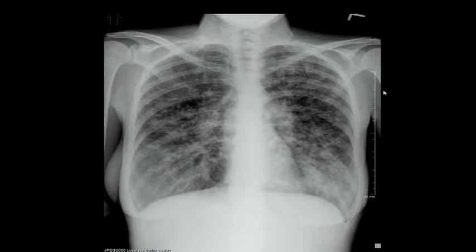All right, this is the next case. So Hunter? Single frontal view chest radiograph, and I see small diffuse bilateral opacities throughout, almost like a miliary pattern.